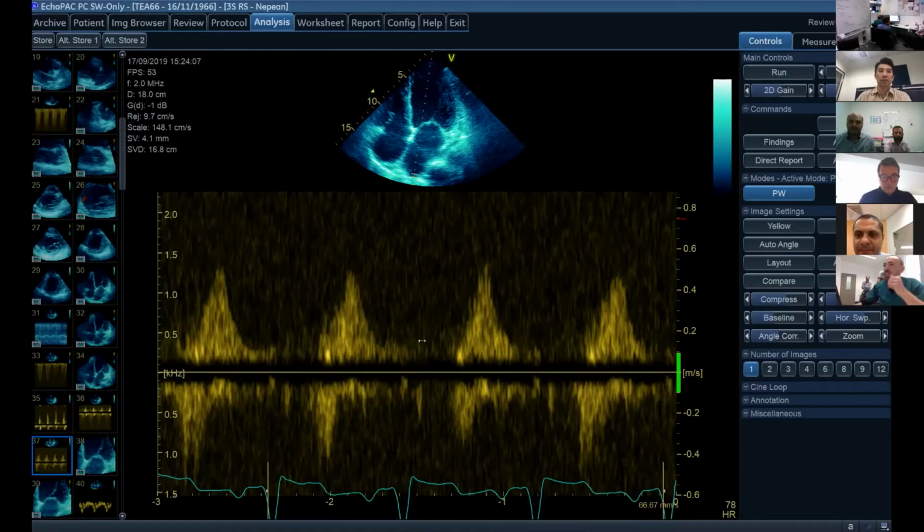So what's the diastolic wave that appears below the baseline? I wonder whether we've got quite a small volume. Is that an artifact? Because it often looks like it's mirrored the baseline, but I'm not sure.